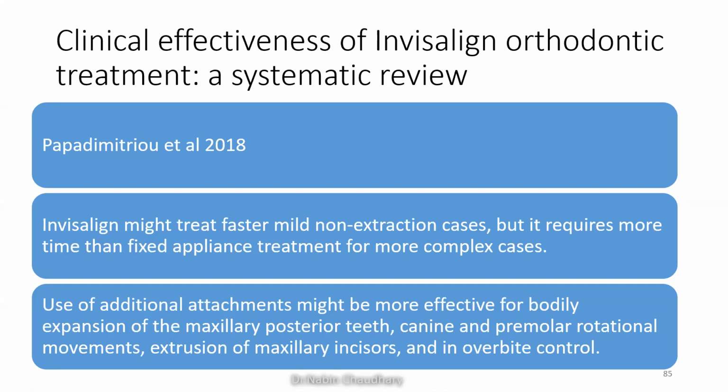Now let's go through some of the recent articles that check the effectiveness of Invisalign compared with fixed orthodontic treatment. This is the systematic review by Papadimitriou et al. in 2018, who said that Invisalign might treat mild non-extraction cases faster, but it will require more time than the fixed appliance when treating more complex cases.